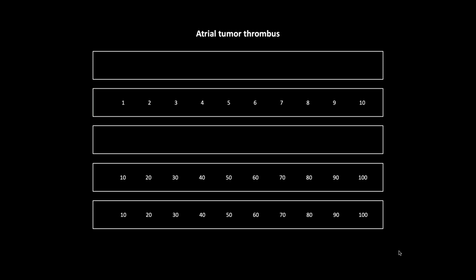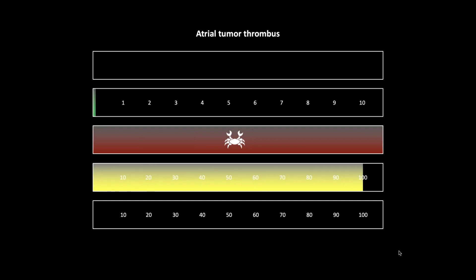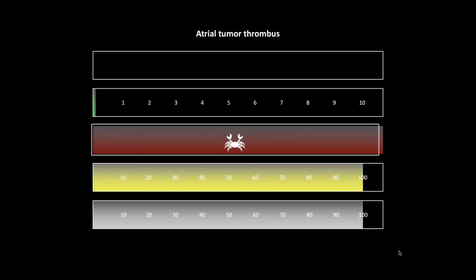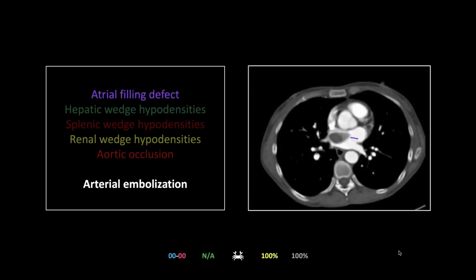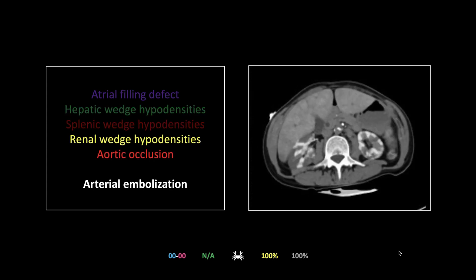Next is an unusual one — atrial tumor thrombus. This doesn't fit with the books; I decided not to give an age range and to simply call this a one-in-a-million finding. Cancer is the risk factor and the mortality is essentially 100 percent. CT was very sensitive in this case. Here is the atrial filling defect, which by itself could just be clot, but look at what it's doing — we have widespread infarcts in the liver and kidneys.